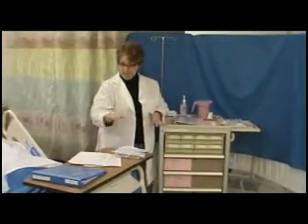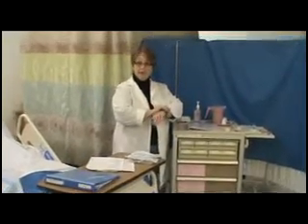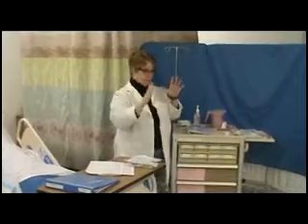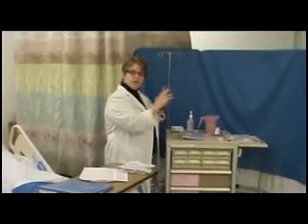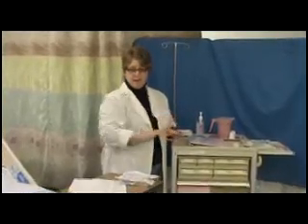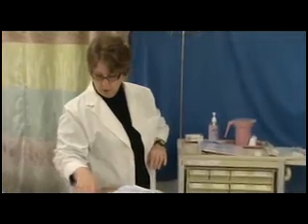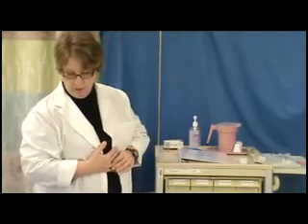There will be another point in the demo. It'll actually be at step 14 or 15 where you're in the room, and you'll check again for patency of the IV site. But for the purposes of entering into the med room, you can verbalize that you're aware that your patient has IV access, and then you'll assess it again when you go into the room. So then you can verbalize that you know that your IV primary solution and your IV secondary solution are compatible. You will have checked that already in your med book.